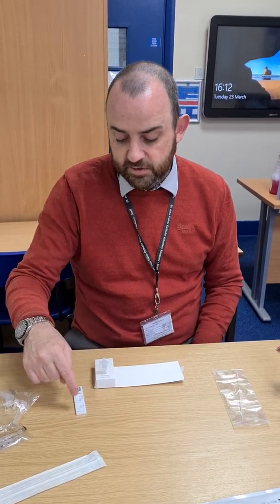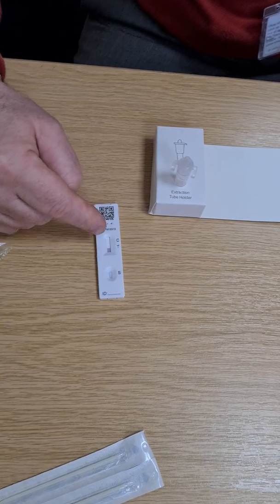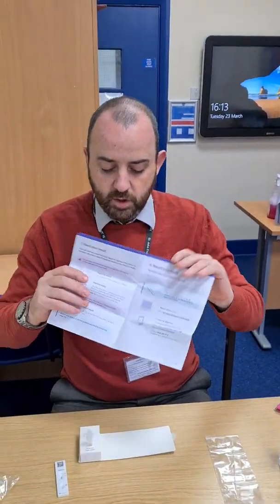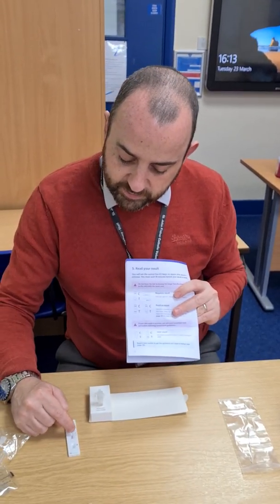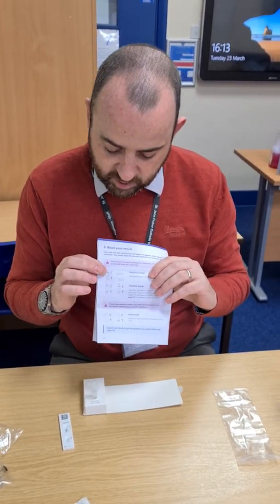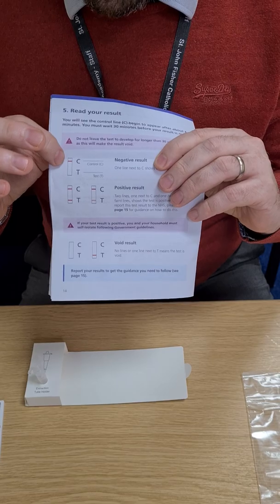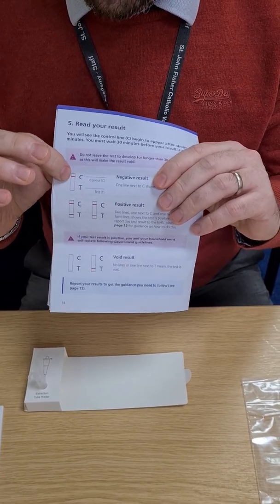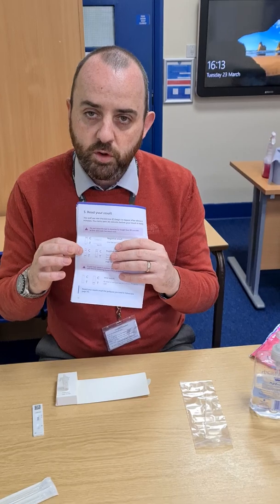You'll now start to see the liquid bleed up into the test — the paper is absorbing it and will record whether the test is accurate. Leave it for 30 minutes. After 30 minutes you read the test result. There are two letters in the test area: C and T. The C stands for control — a red line across the C means the test has been successful, which does not yet mean positive or negative. Set a timer for 30 minutes and read the result after that time.